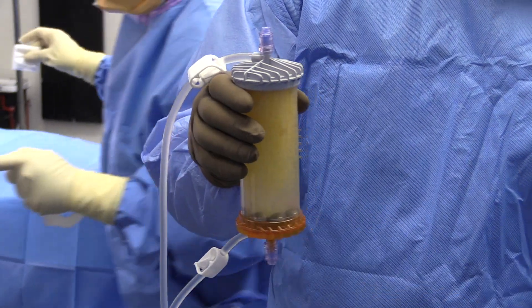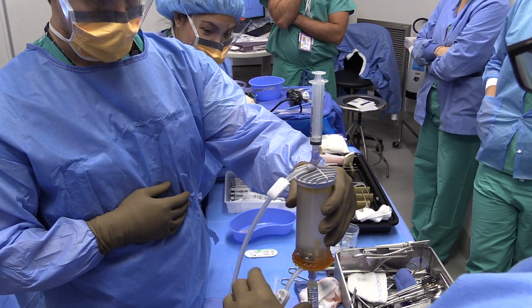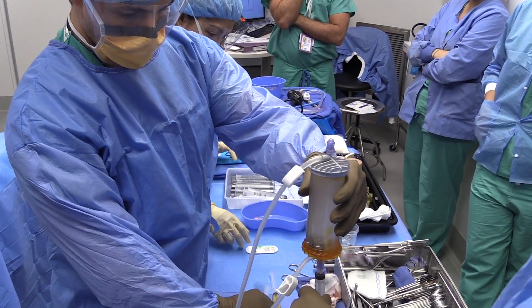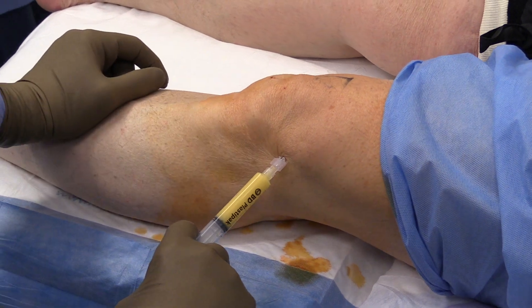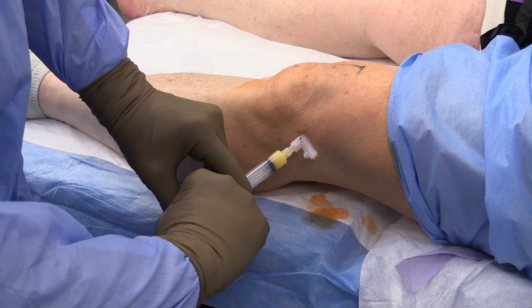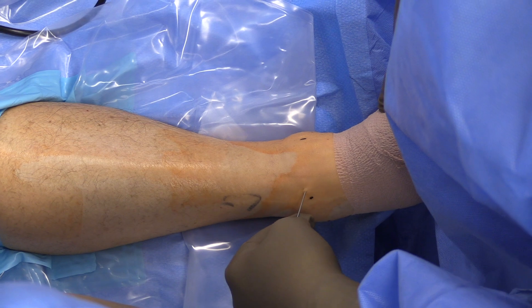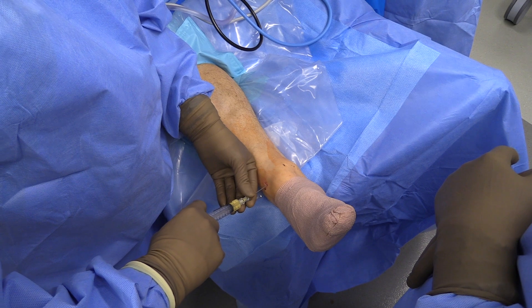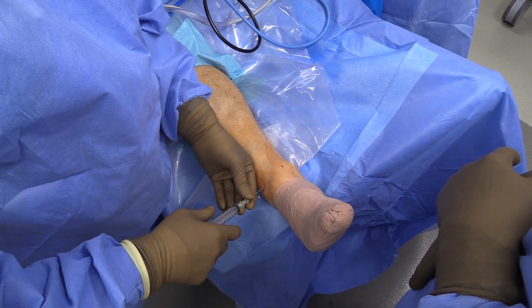Further agitation is performed and the stem cells are then harvested. The knee is injected with 10 cc's, and the ankle — using fluoroscopic confirmation — is then injected with the adipose cells, both receiving 10 cc's each.